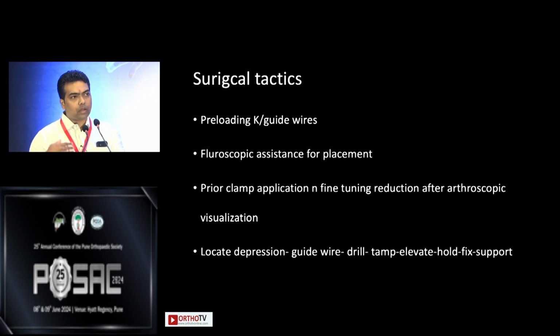Therefore, arthroscopic assessment and preloading the K wires or guide wires up to the fracture site is a very important concept. We need fluoroscopic assistance for placement of those guide wires, because arthroscopy will not give us a way to assess where we need to preload the wires. Therefore, fluoroscopy is most of the time needed.